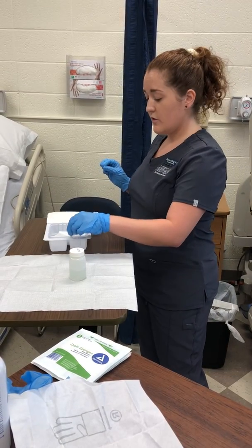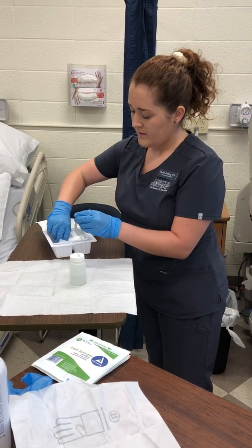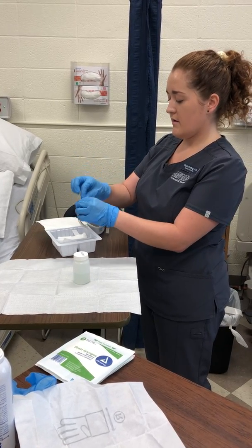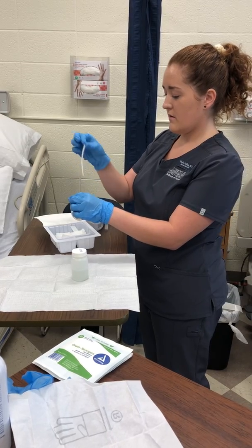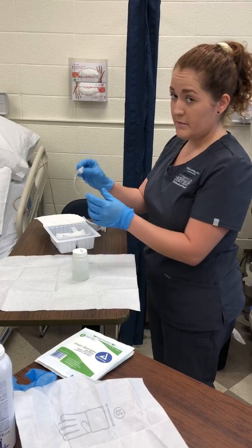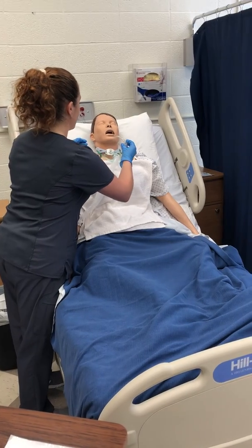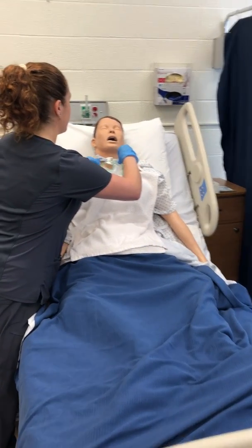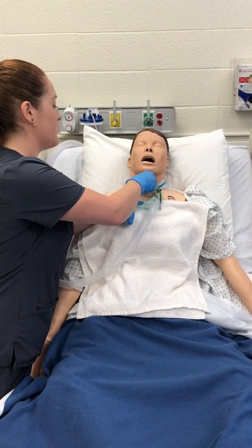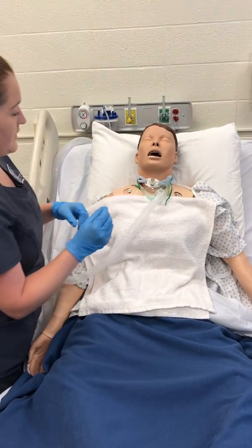I'm going to rinse the inner cannula in the normal saline solution. Then I'm going to use a pipe cleaner — also found in the kit — to dry it, and discard that. Using my dominant hand, I'm going to reinsert the cannula, trying to maintain sterility as much as possible. You push it in until you hear a click. Now that is done.